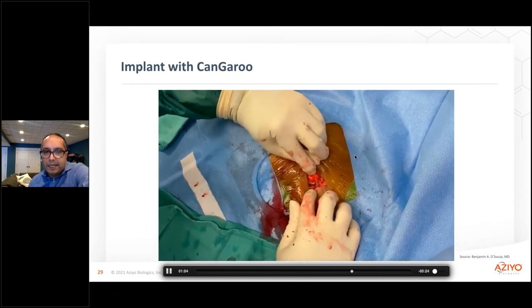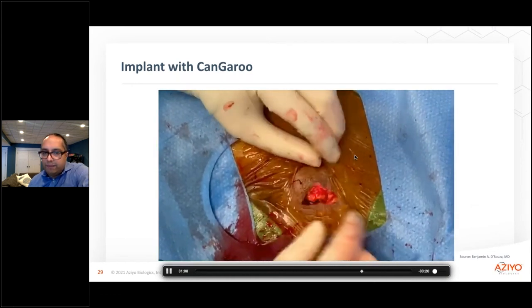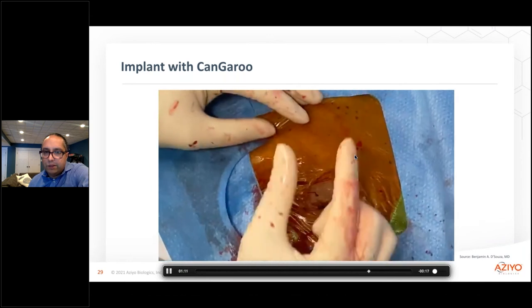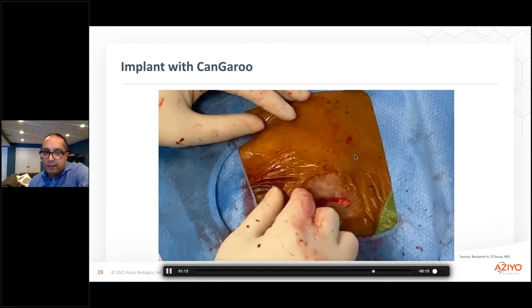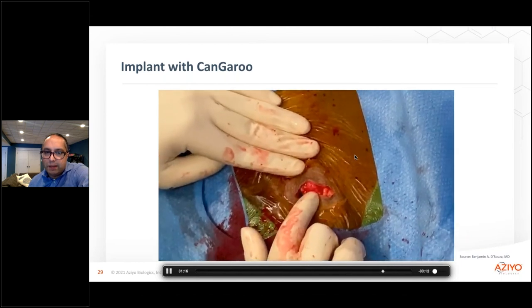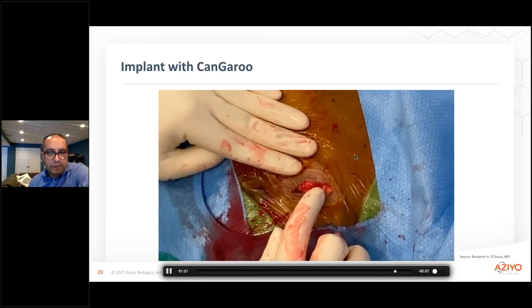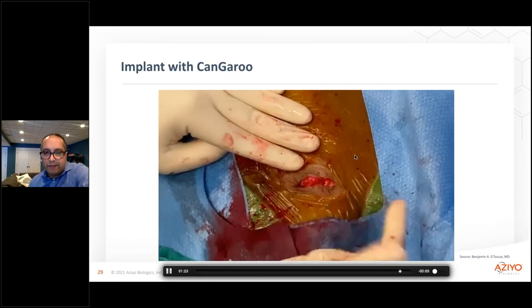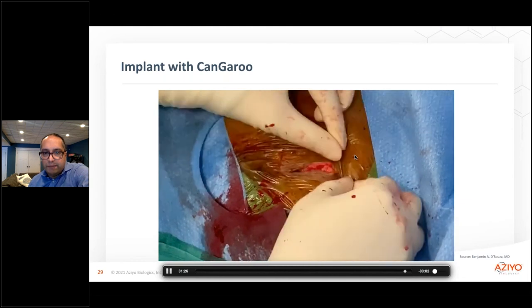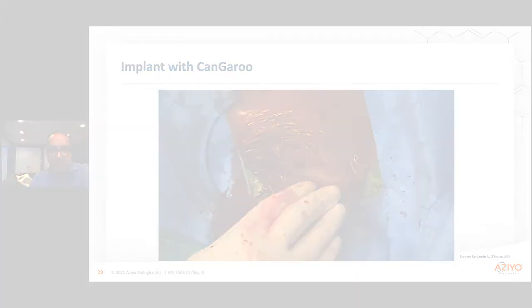But you can see there that it fits as a nice snug location for me to be able to close down and make an incision as small as possible. This was another very thin-skinned person that doesn't have a lot of tissue, trying to avoid any issues related to closure of the device. I would recommend that you actually feel the difference between the pouches, because you can feel the difference. And then when you actually use it in terms of implantation, it's very easy and straightforward.